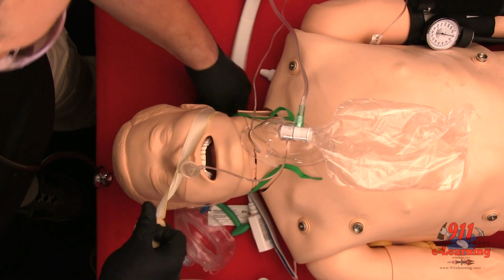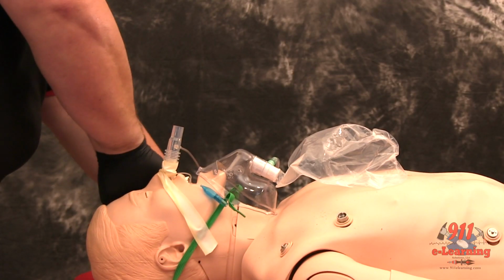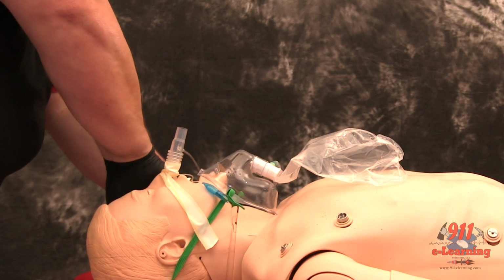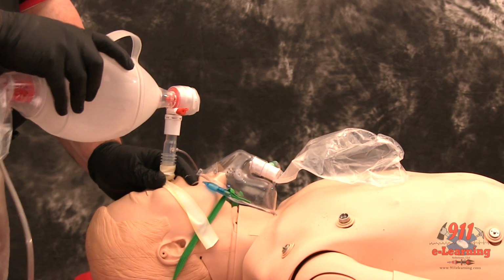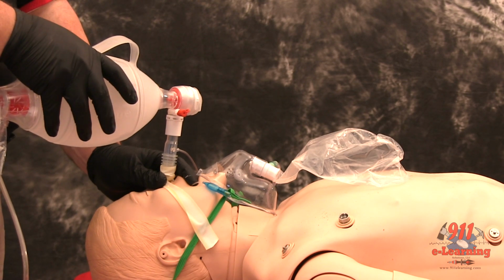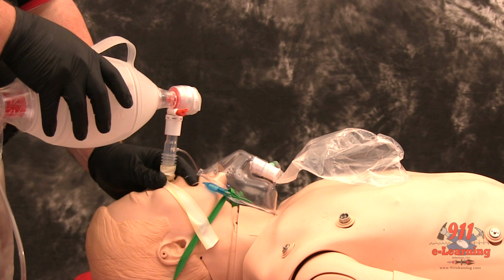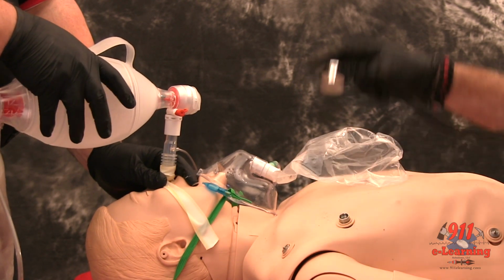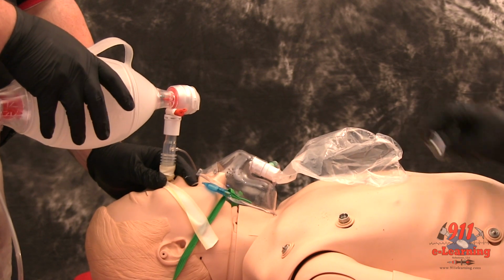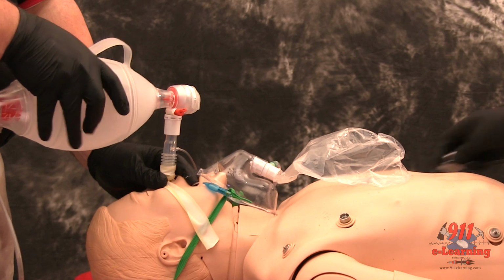Reassess airway and breath sounds after transfer to the stretcher and during transport. These tubes are easily dislodged and require close monitoring and frequent reassessment. Document the procedure, time and result, success, on or with the patient care report, PCR. It is strongly recommended that the airway, if equipment is available, be monitored continuously through capnography and pulse oximetry. It is strongly recommended that an airway evaluation form be completed with all intubations.